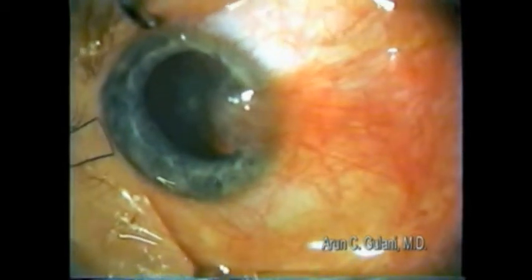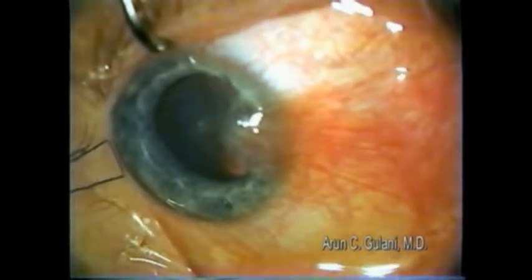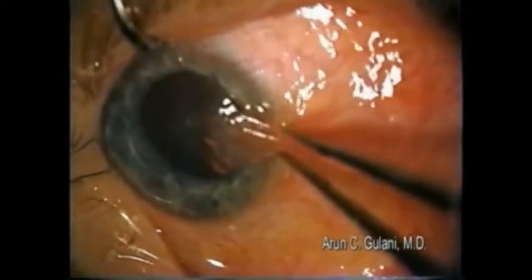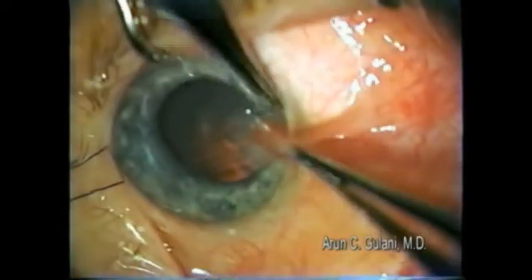This is a pterygium. In this case you can notice the fixation suture at the lateral limbus. My technique for removing the pterygium involves no cuts on the cornea.